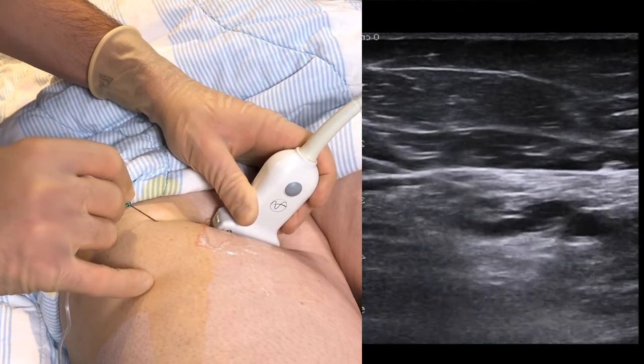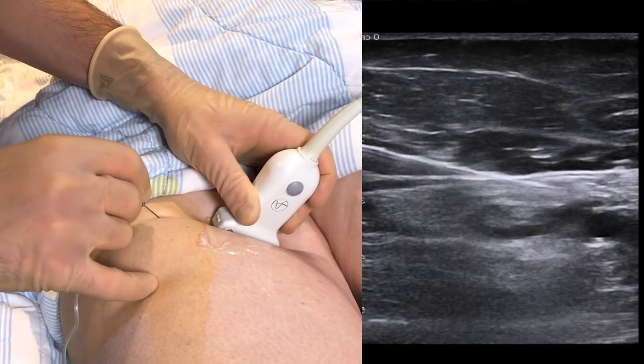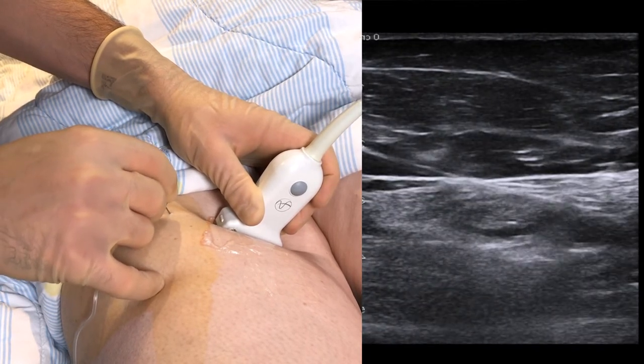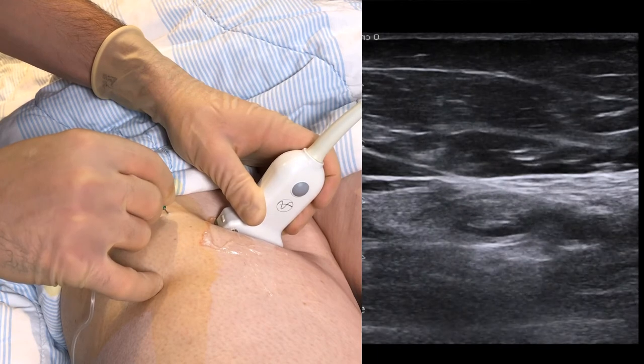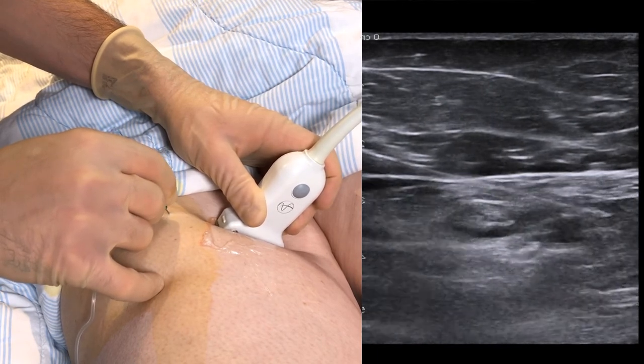Now retract the needle, and then approach the artery at a shallower angle to reach the other side. We place the tip of the needle under the sartorius muscle fascia, and we can see how the muscle rises as we inject the local anesthetic.